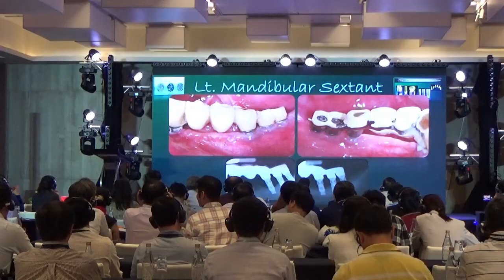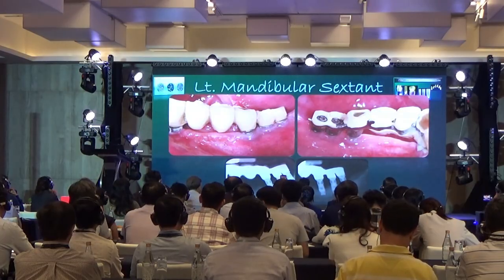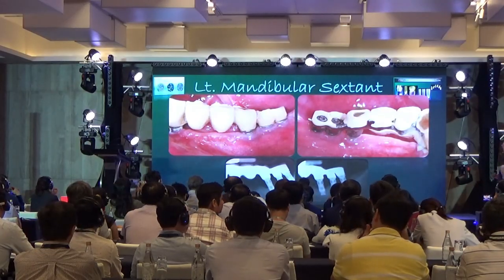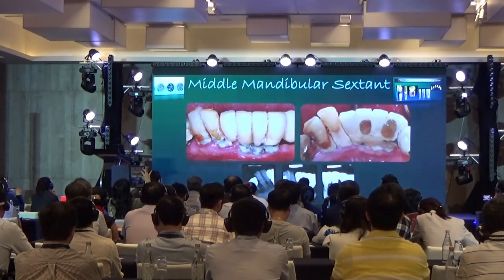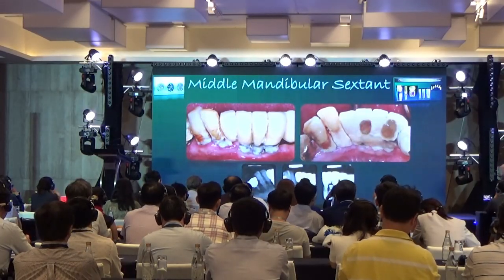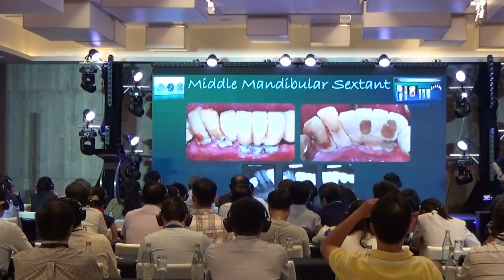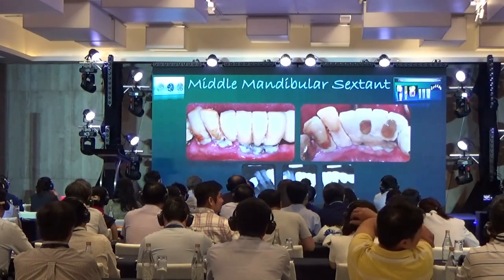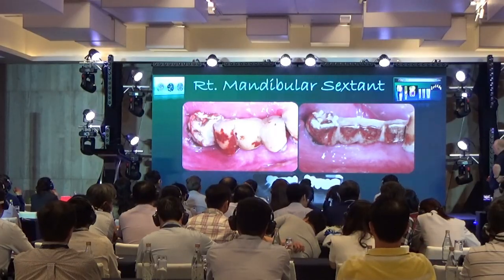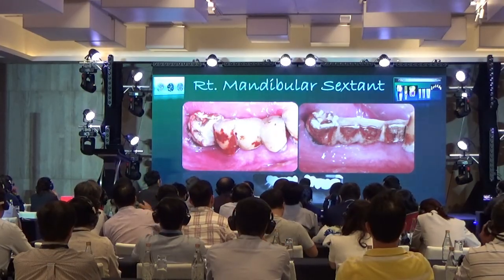We go to the lower jaw. Well, basically those 2 implants, maybe they can support some interim prosthesis. This implant has too much bone loss and periimplantitis, so we probably need to remove it. Here, I don't think we can do much, but those implants seem okay. I mean, we have some bone loss, but not too much. So maybe we can also use them. And again, maybe we can use those for something interim, but of course not for something which is permanent.